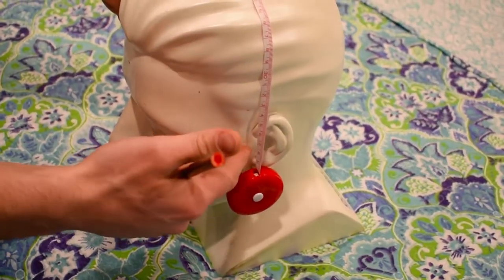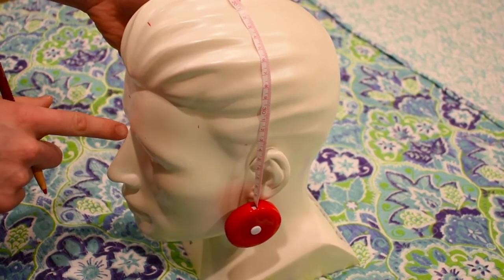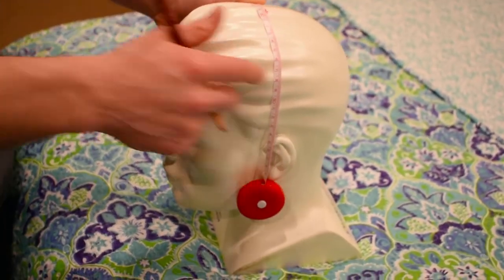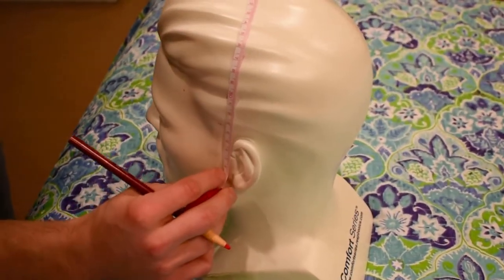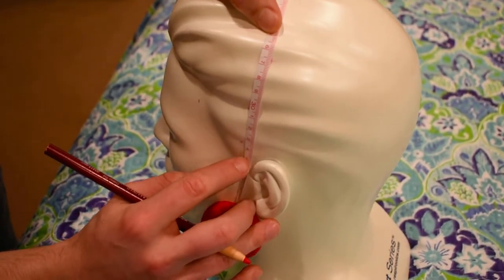And then, same thing, 10% up from the left and right preauricular sites, the same thing that we did from 10% up above the nasion and 10% up above the Inion. So again, 10% of 38 centimeters is 3.8. So we're going to go ahead and do that. 1, 2, 3, 3.8.